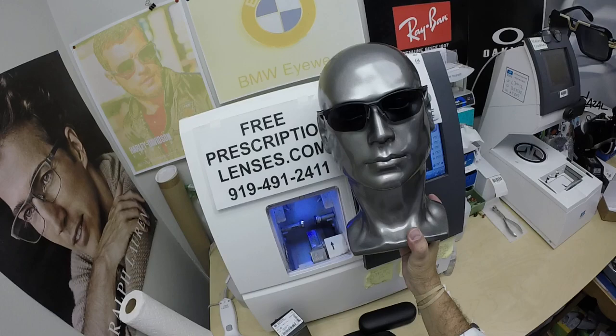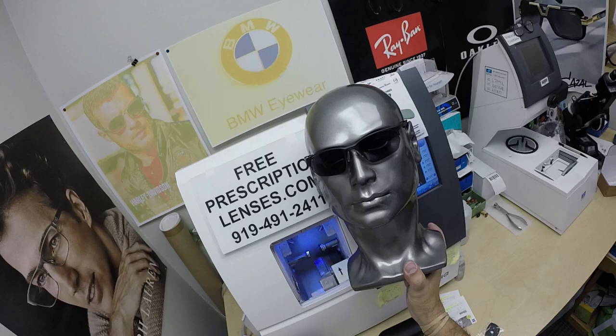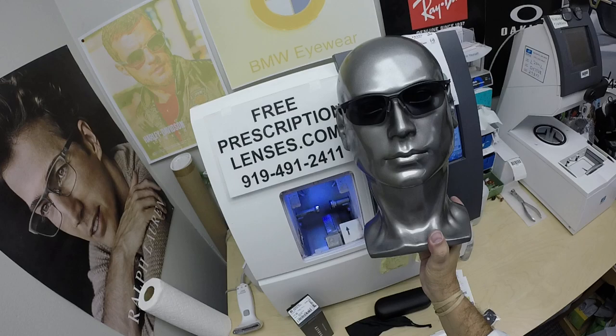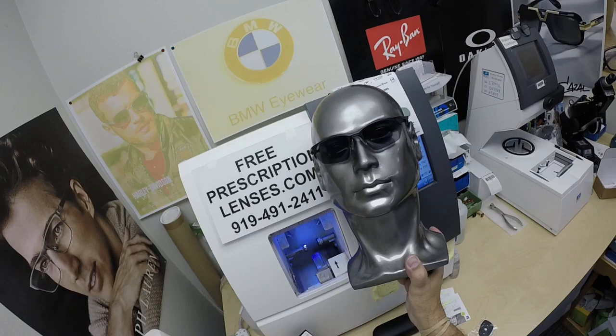The frame is $320 and comes with one free pair of clear single vision prescription lenses. The Photofusion Gray adds $99 — and the gray, brown, green, or the blue that I love all add $99. The DuraVision Platinum, the most premium anti-glare from Zeiss, adds another $99. The Photofusion Extra Gray, designed for extra active people who spend extra time outside and want the darkest lens possible, adds $129. All prices are tax-free with free shipping anywhere in the U.S.